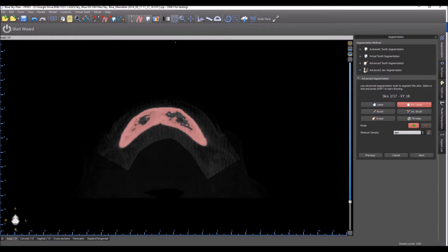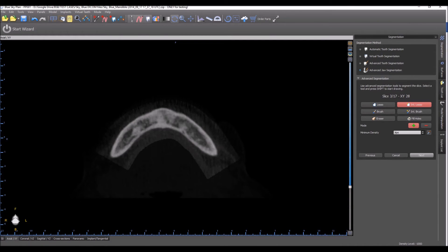When we have holes we want to use the fill holes button to fill that in, so that we end up with a solid model.